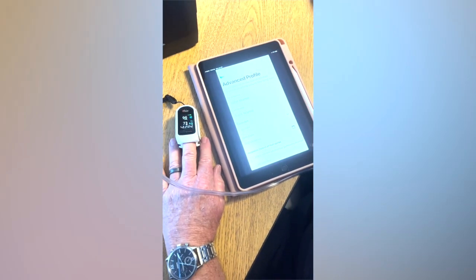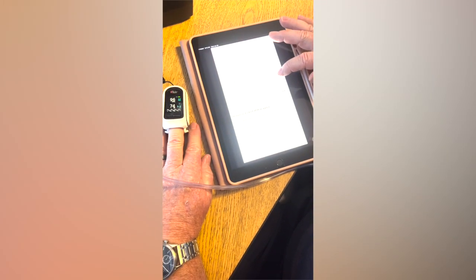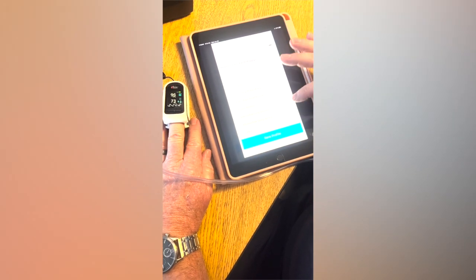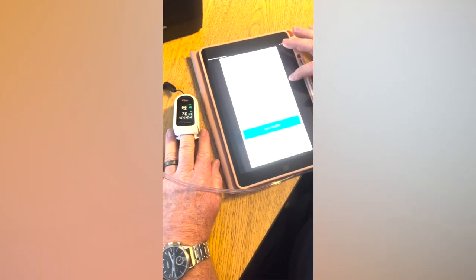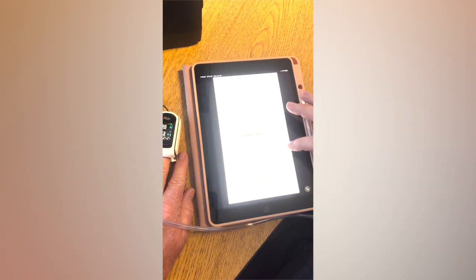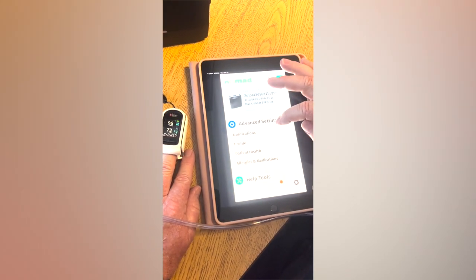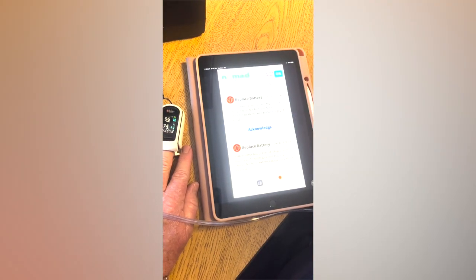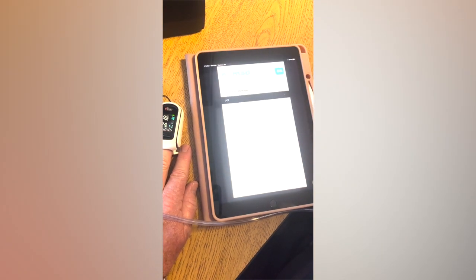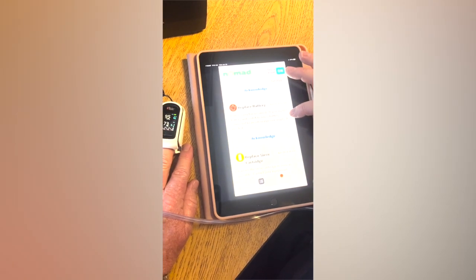Additional data includes replacing the battery when it's running low on charge. These are the warnings or acknowledgements, such as time to replace the sieve cartridge. You can get things such as a power failure, all types of data that will be provided. In this case, it's also telling you to perhaps do some maintenance, such as clean and reset date, for example, on an intake filter. You go in, this is the filter, it gives you instructions on how to do it, and then you set the date for when you need to.